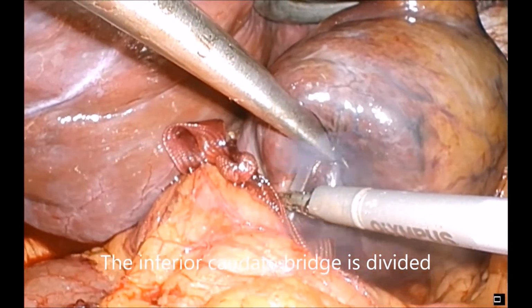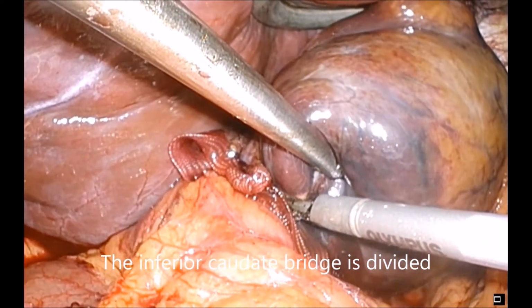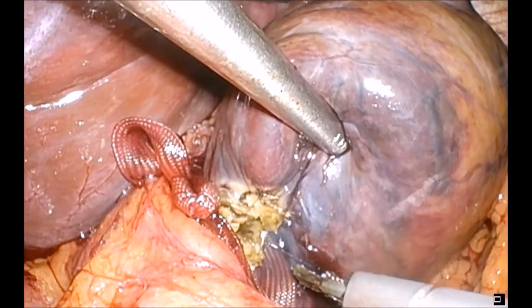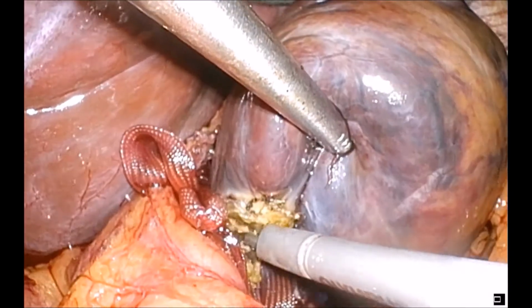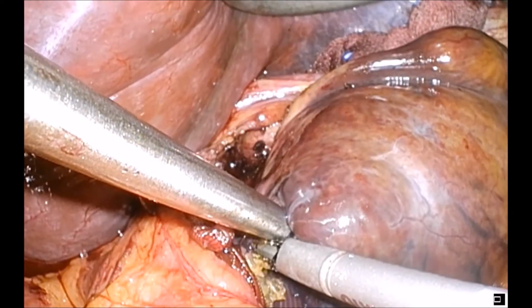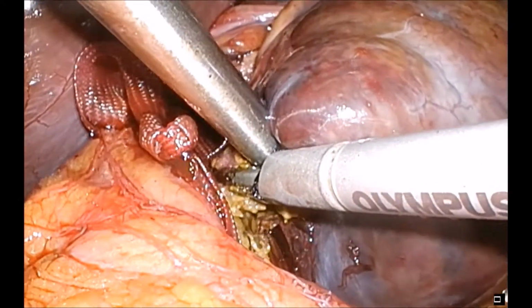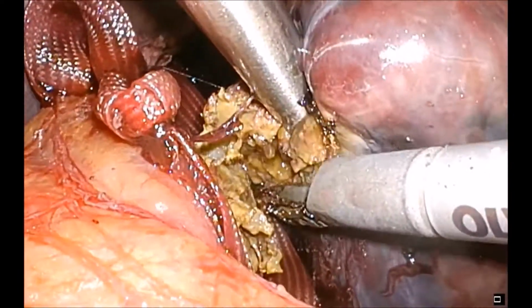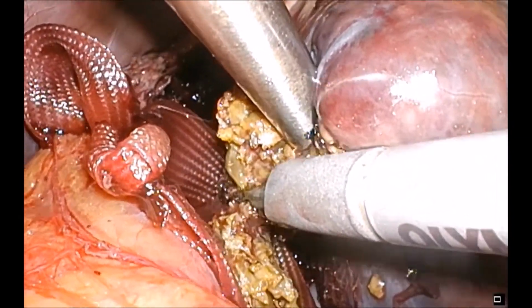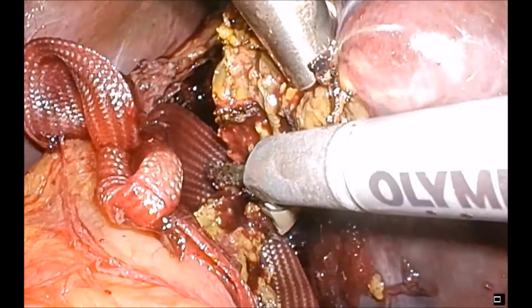We start to take that bridge of tissue over the front of the shunt now, just using the Thunderbeat as a dissector and vessel sealer. There are no major vessels running through here, although there is a small vein that requires attention with the bipolar. And care is being taken through the placement of that tape not to damage the underlying shunt.